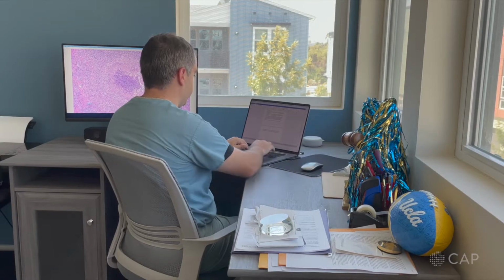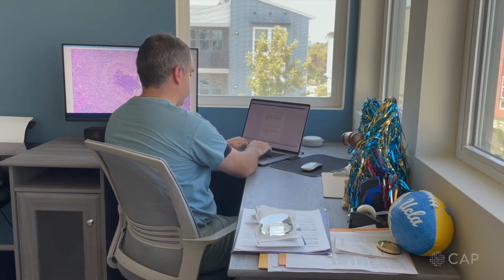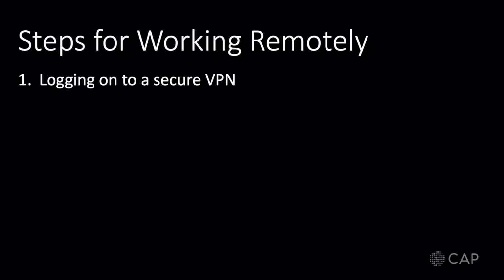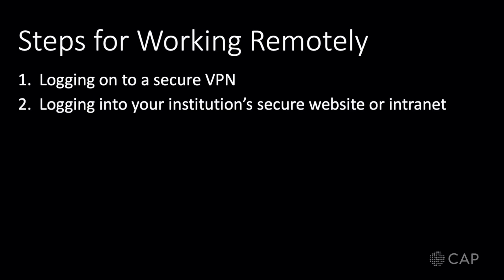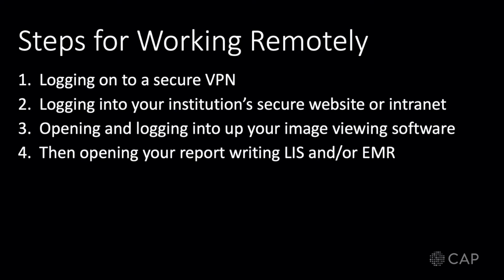I also want to acknowledge that this is my institution's workflow operations. Yours may be different, but the general principles still apply. The main steps are: 1. Logging onto a secure VPN. 2. Logging into your institution's secure website or intranet. 3. Opening and logging into your image viewing software. 4.